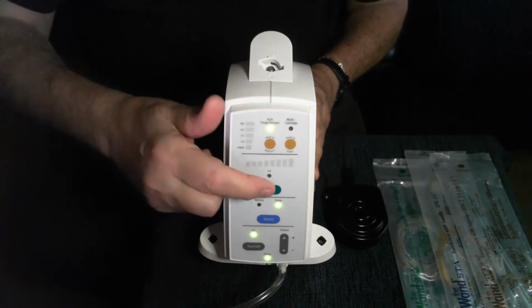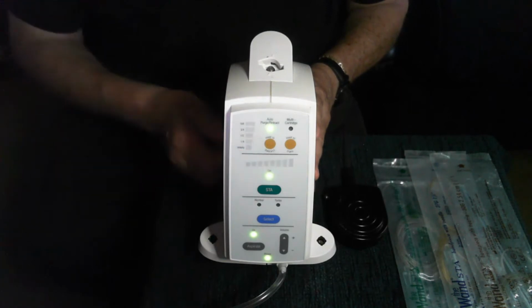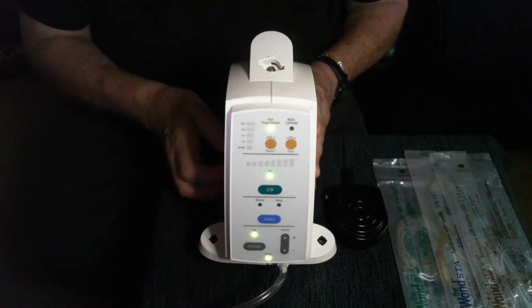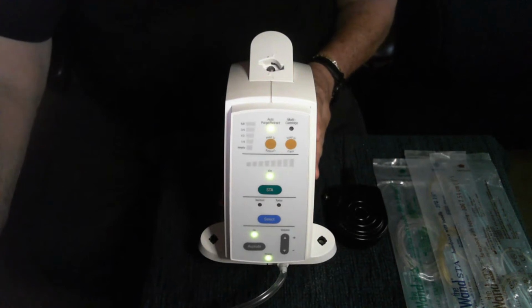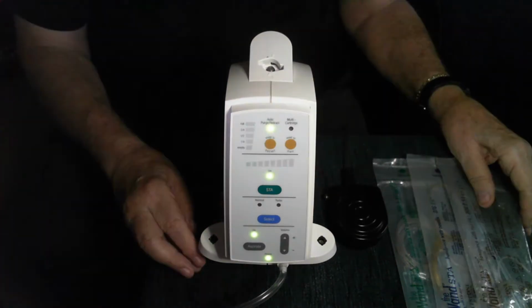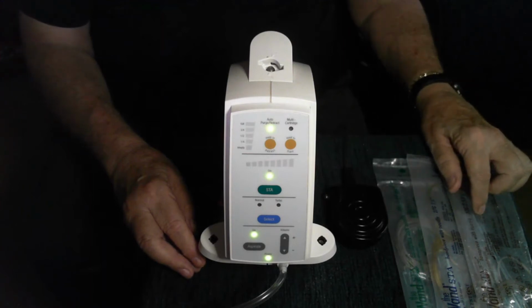Also, we're going to show you that these lights here are called the DPS lights, and they're going to be used whenever we do a single tooth injection, an interligamentary injection, by guiding us to the proper spot to give the injection. We use what we call wand handpieces, and they're in 3 different sizes.